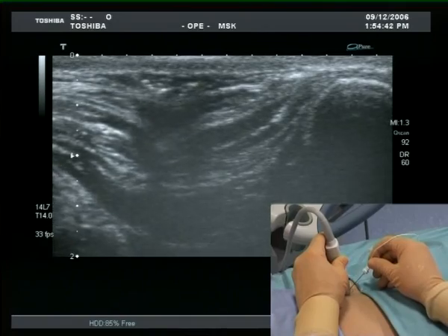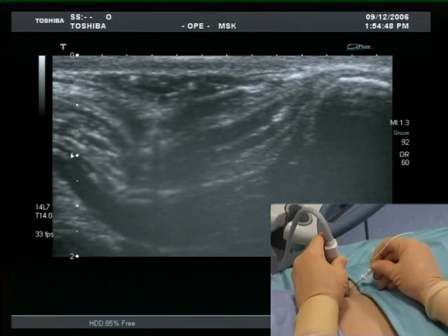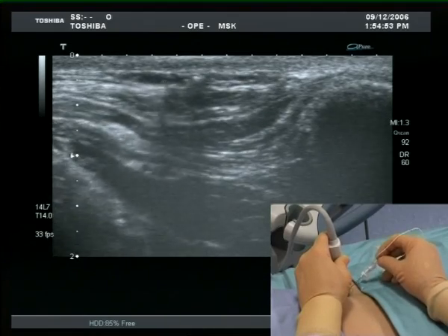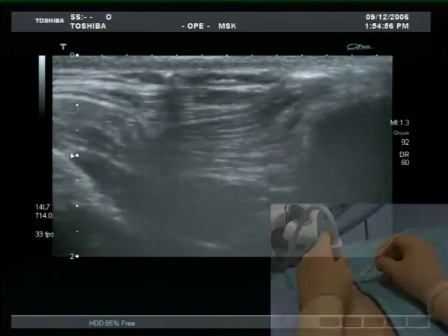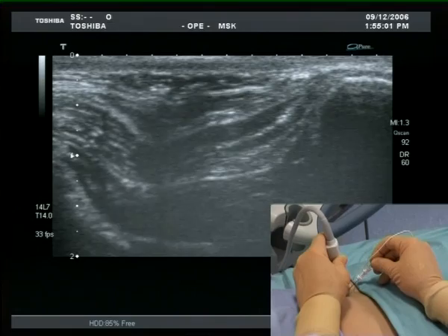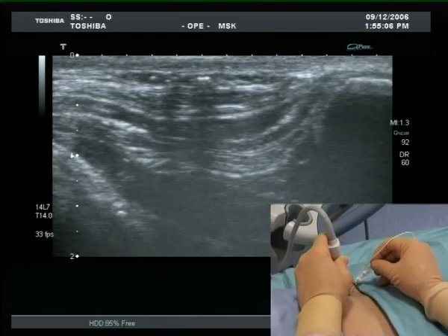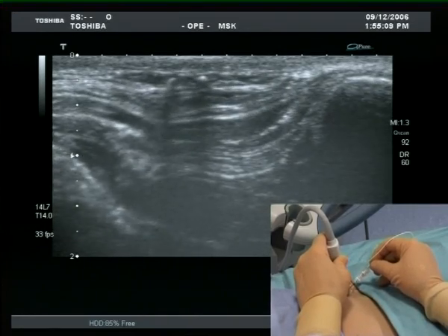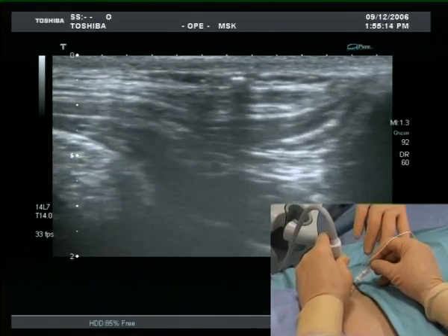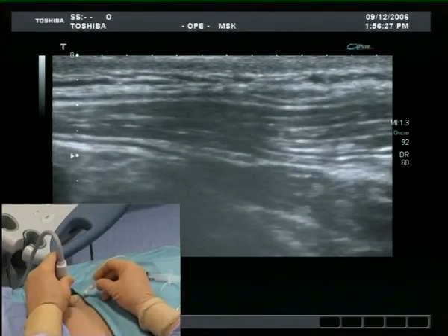The needle appears in the middle of the ultrasound image. Small movements of the needle cause visible tissue displacement, which confirms needle tip position. This can be seen on the ultrasound image.